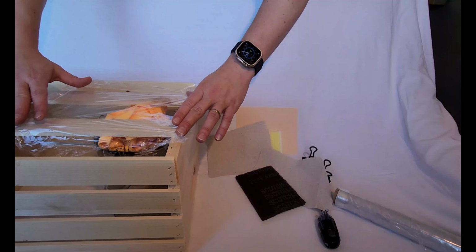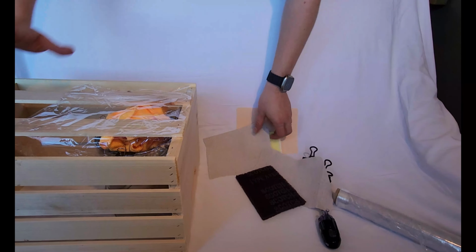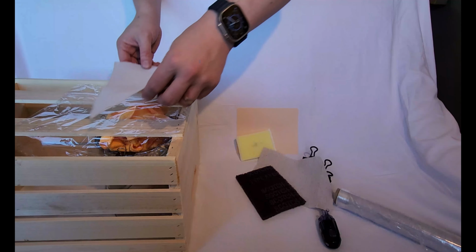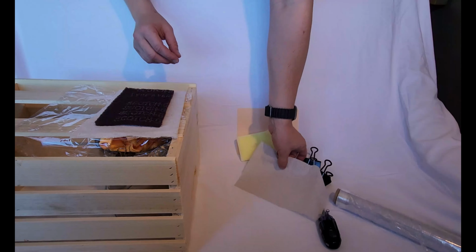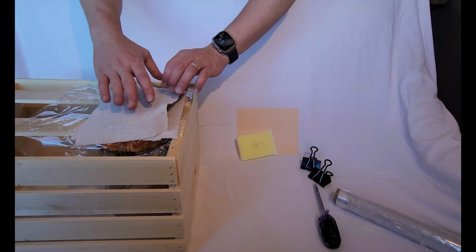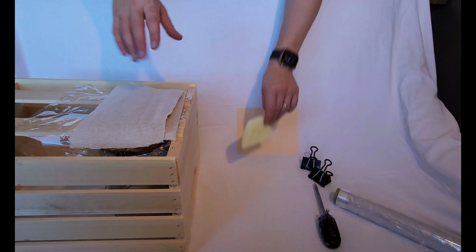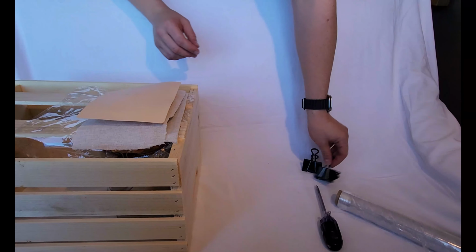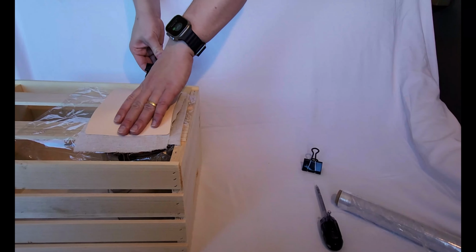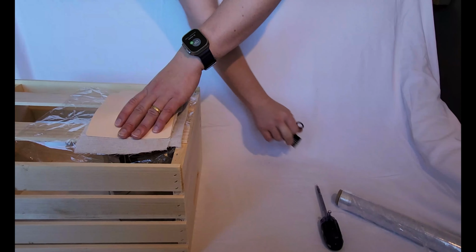Next, we will place plastic wrap as peritoneum and place a canvas sheet to represent the posterior rectus sheath. A scour pad and canvas are placed to represent the rectus muscle and anterior rectus sheath. A sponge is then used to represent the subcutaneous fat and covered with tattoo skin. All of these layers are held in place with clips.